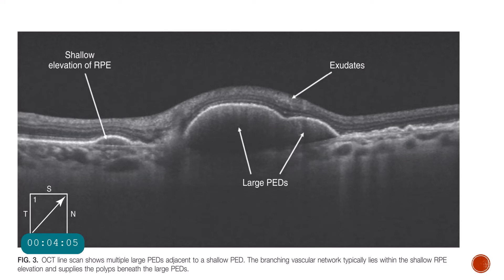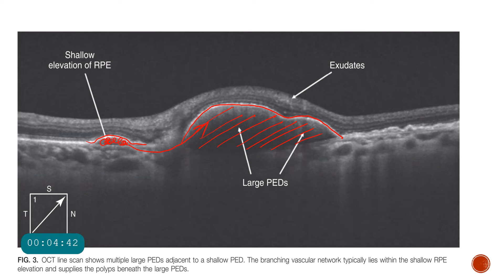In this OCT picture, you can see a big retinal pigment epithelial detachment. The RPE is not seen within it, so this is likely a sanguineous pigment epithelial detachment. Adjacent to that you can see a shallow pigment epithelial detachment. The branching vascular networks are considered to be present within this shallow PED, feeding the tall PED which houses the polyps. Because there is blood within that tall PED, we are not able to see the polyps.